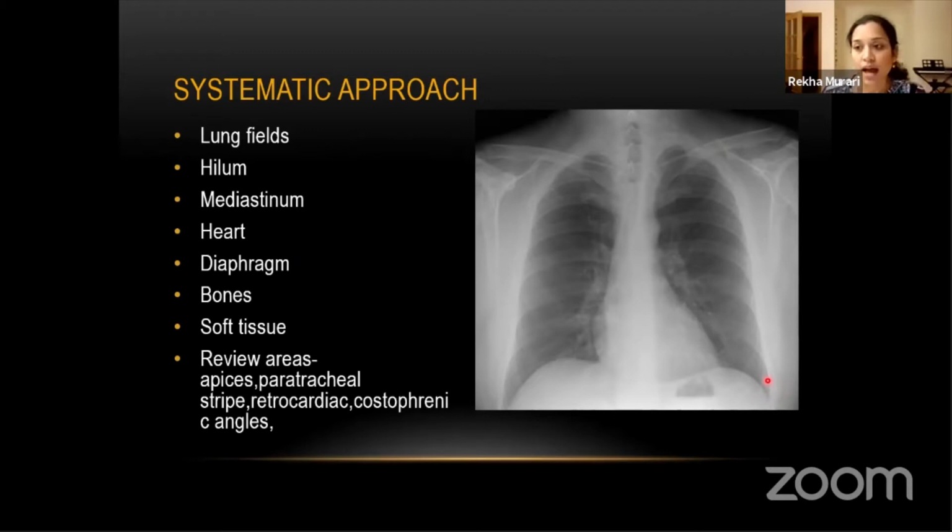And you can also add under the diaphragm, gas under the diaphragm, as your review area, because that is again clinically very significant, and it's important to diagnose it even if it's small.